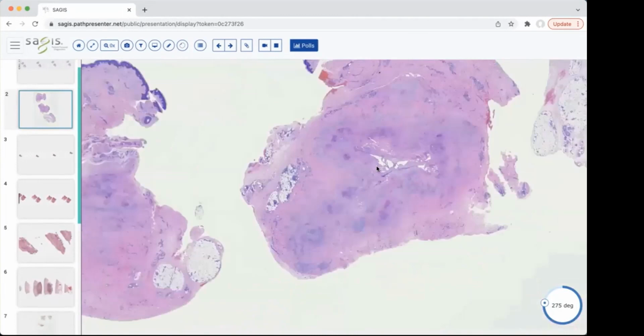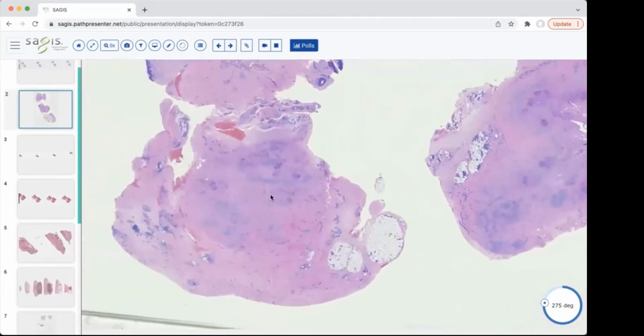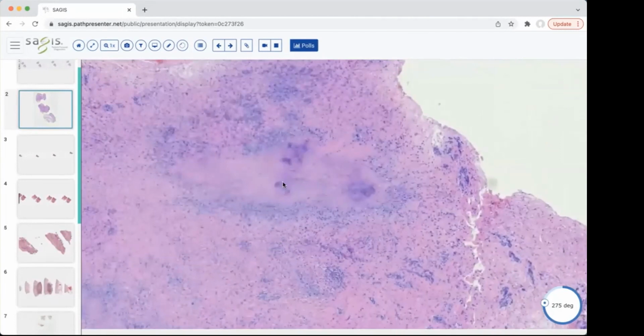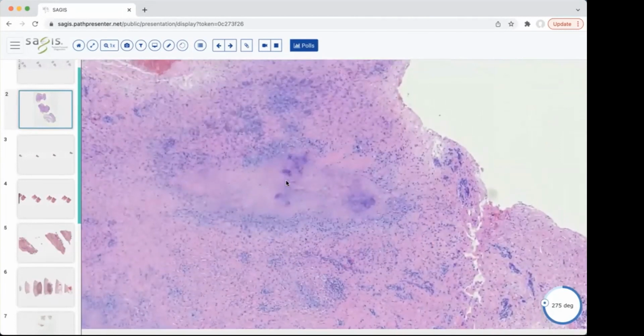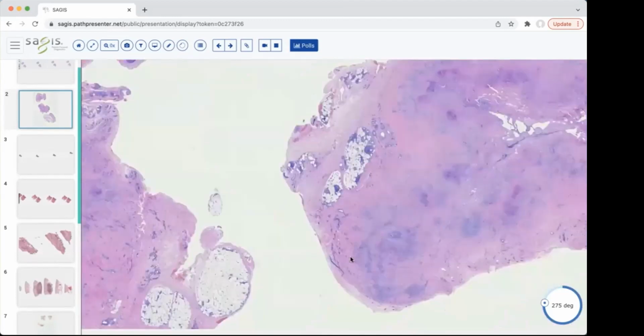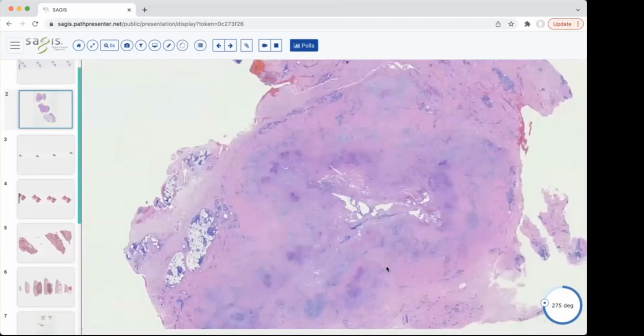We'll go over to another piece here just so you can sort of see. If you only got this cut here, it's a little out of focus, I know. If you only got this cut here, you can still see that there's a nice palisade. Maybe you think about it being a little bit more blue, but taken in context, with this cut here, there's that nice red color for a rheumatoid nodule. So a good palisading granulomatous dermatitis, which is deeply set with a red center.